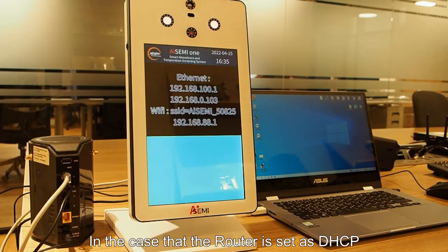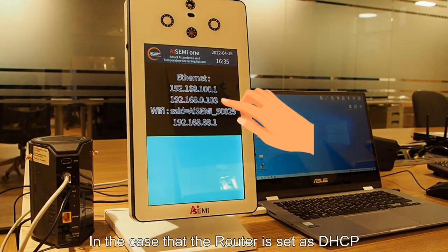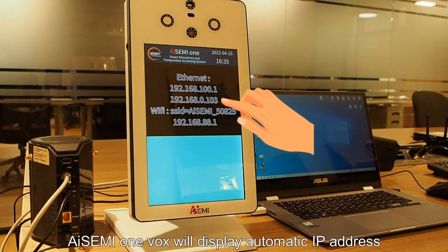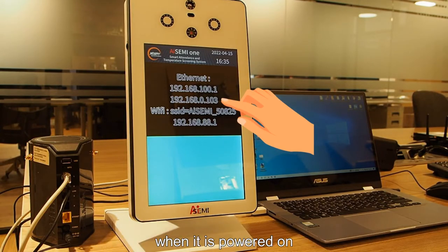In the case that the router is set as DHCP, AiSEMI one vox will display automatic IP address when it is powered on.